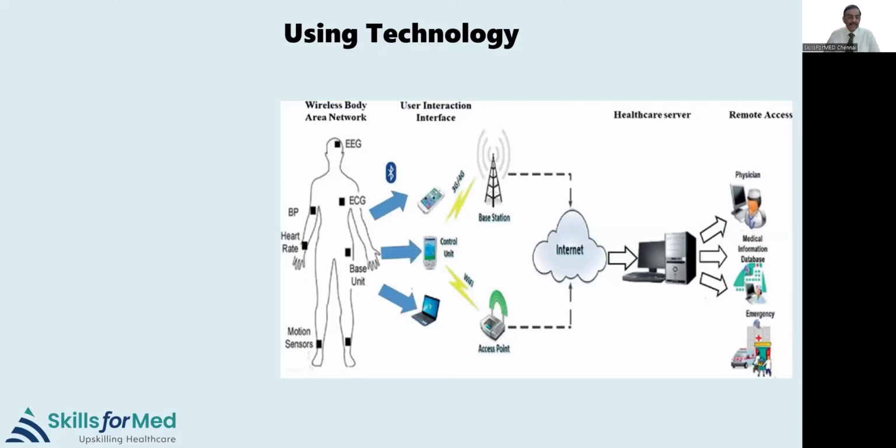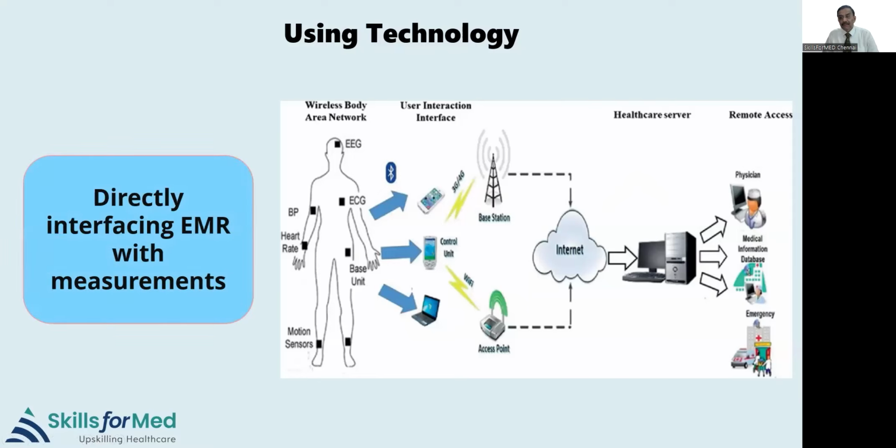It is available today. As you can see, you could just put those probes under the patient and use an interface. Either it is a phone-based interface or a tablet or whatever. Now it is the mobile, which is used most of the time. Then there is a wireless which will go to the cloud, and then those values are directly entered into your electronic medical records. It's not very expensive. Now, it is more expensive than just doing your own thing. But if you look at quality and reducing errors, definitely it'll pay the cost in a few years.